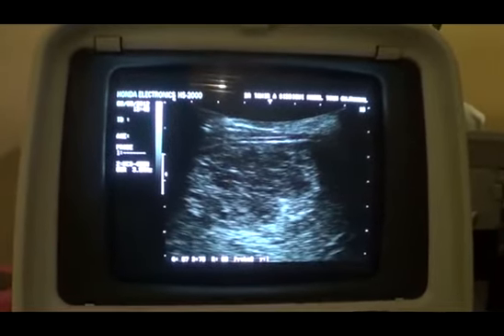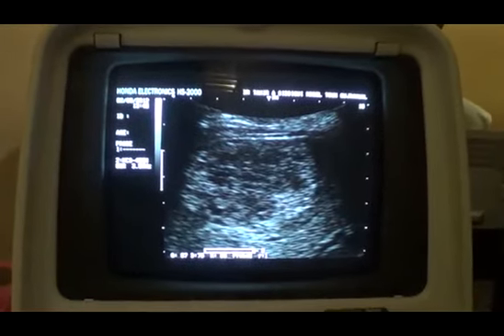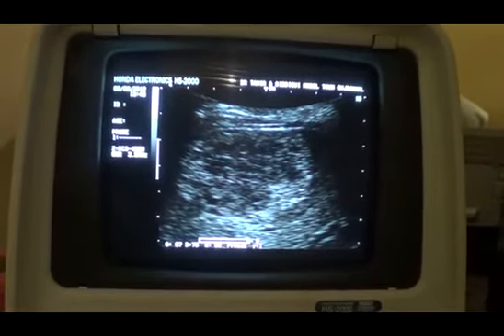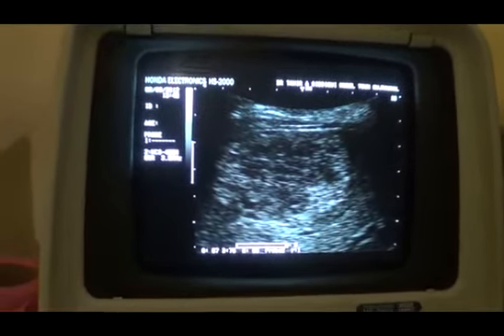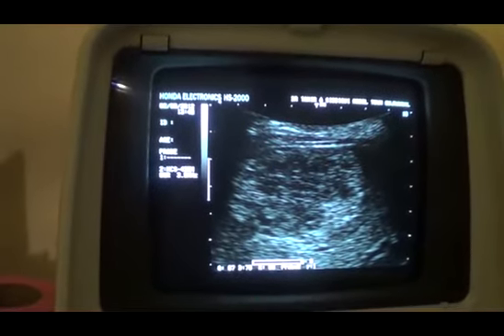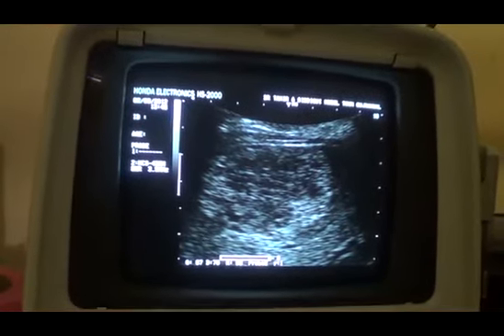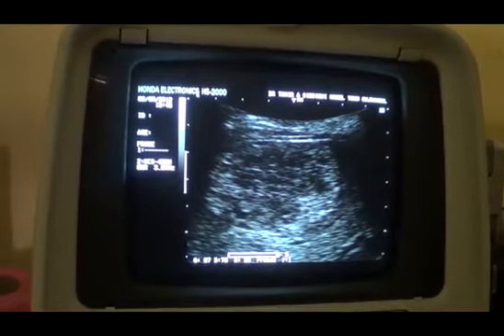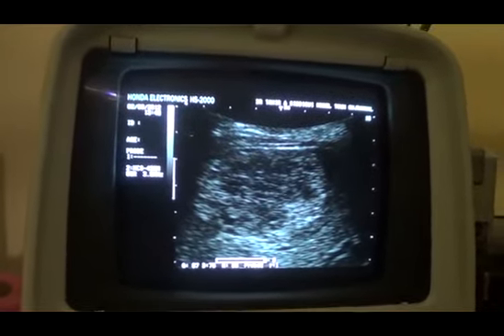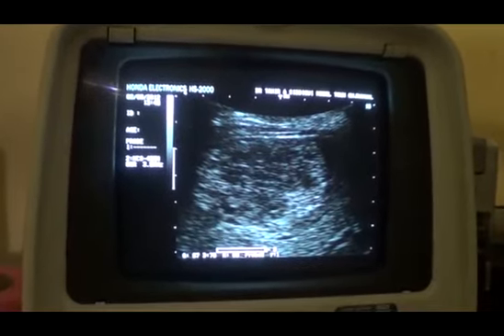Now this can be tuberculoma, number one. Number two, this can be hemangioma, necrotizing hemangioma, large hemangioma, without any investigations. I do not have any lab findings or clinical notes or complete history of the patient. He has just complained of pain in the epigastric region. That is the only complaint.